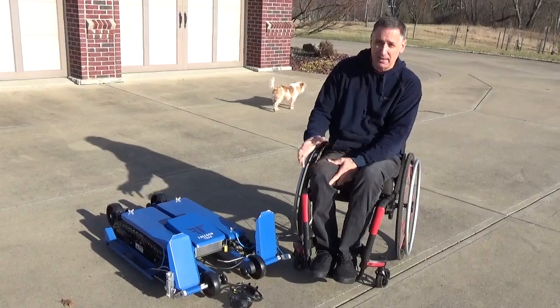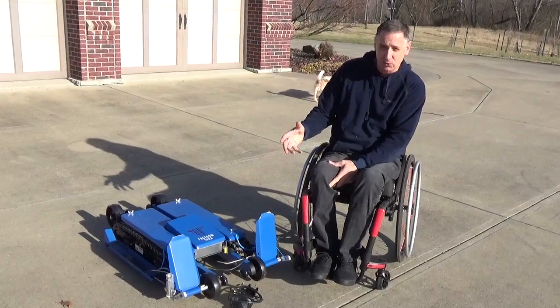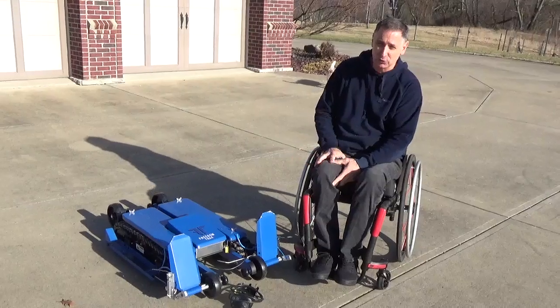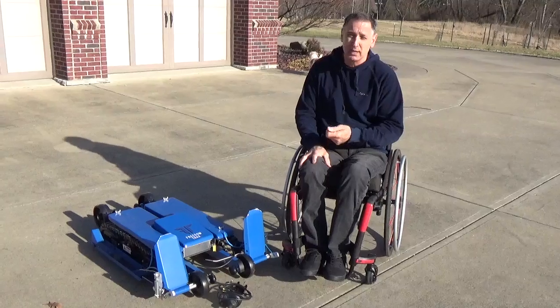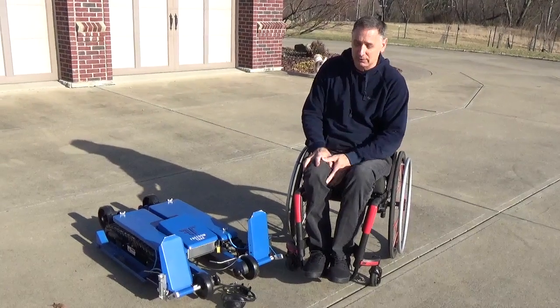I'll show you how I get mounted in it. When I ordered it, I told the manufacturer the size of the wheelchair that I'm in. He built it and fit it for that. There's another video I have that shows it getting unpacked, so you can see what it was like whenever it was shipped.